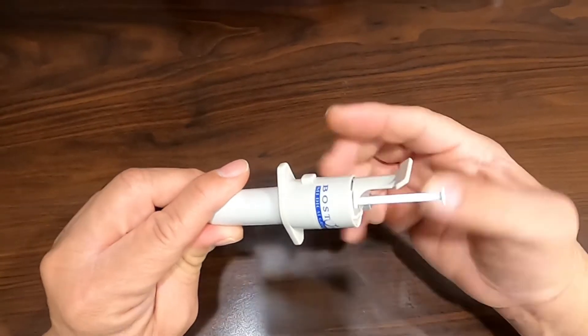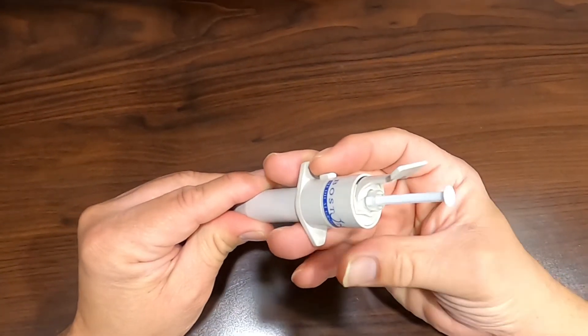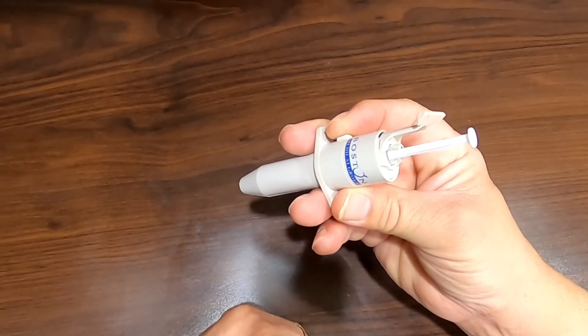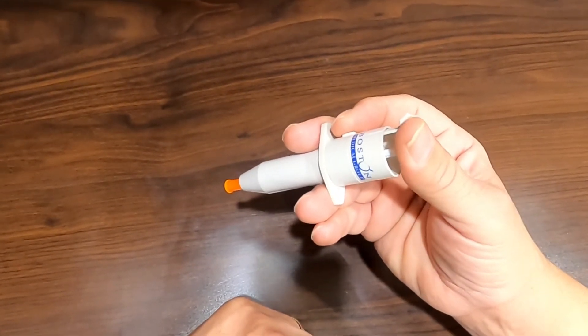The best way to hold the applicator is by placing it between your two middle fingers with your index finger on the button. Your thumb can rest on the opposite side. To apply the medication, simply press the button with your index finger and push straight down on the plunger until it stops.